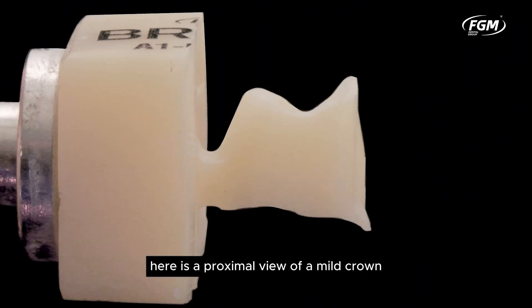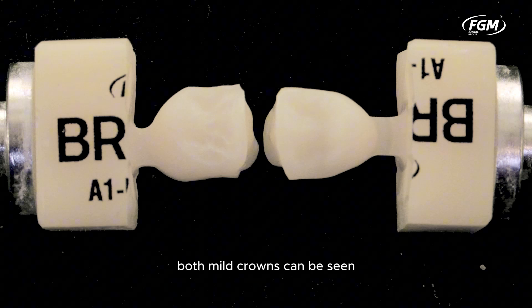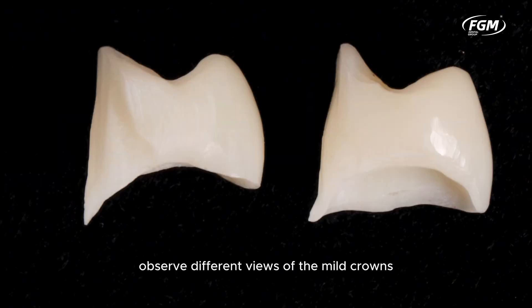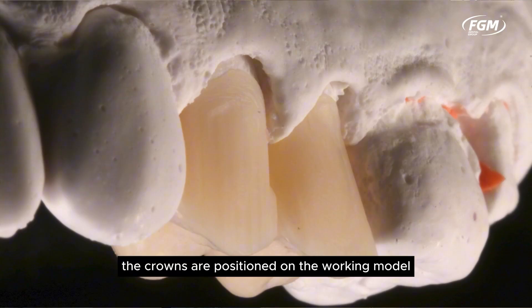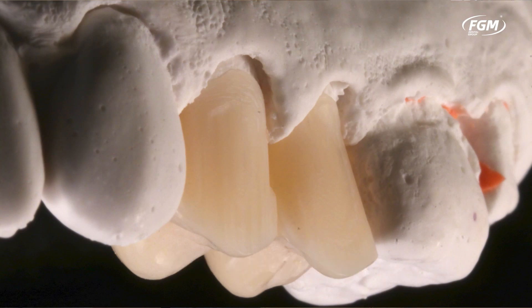Here is a proximal view of a milled crown. In this other occlusal view, both milled crowns can be seen. Observe different views of the milled crowns positioned on the working model in plaster. You can notice the vestibular reduction performed for the subsequent fabrication of direct composite resin veneers on both crowns.